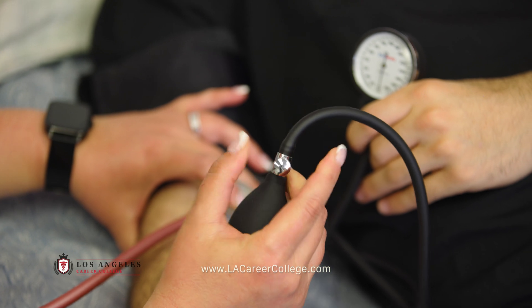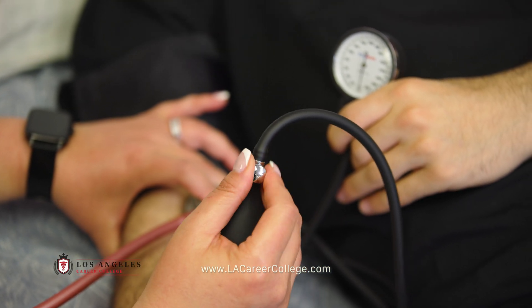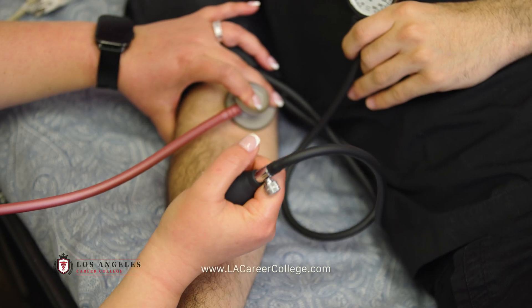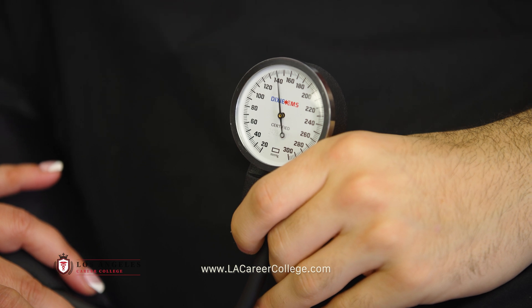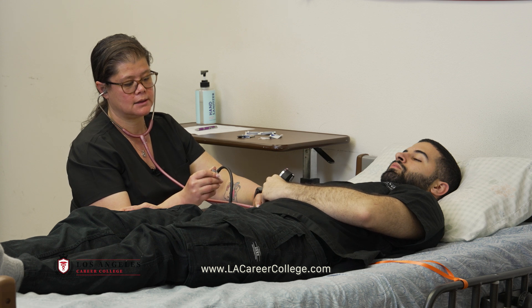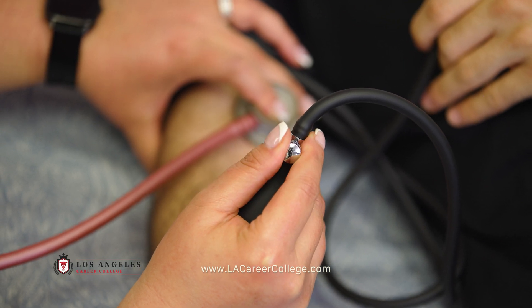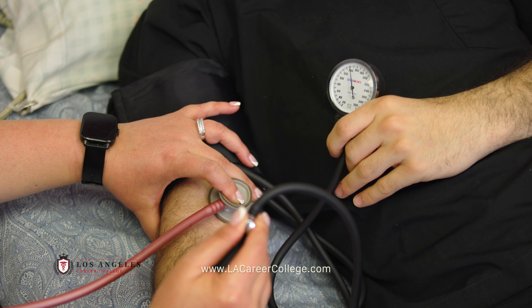Make sure that your valve is turned all the way clockwise before pumping. You're going to pump all the way up to between 160 and 180 millimeters of mercury, and slowly release the dial in the counter-clockwise direction, about two millimeters of mercury per second.